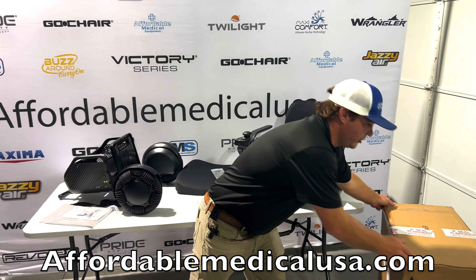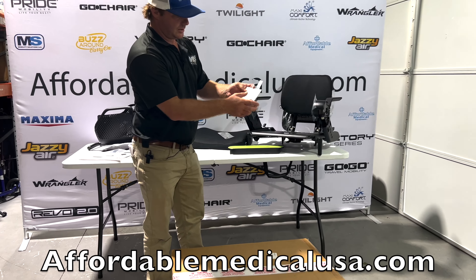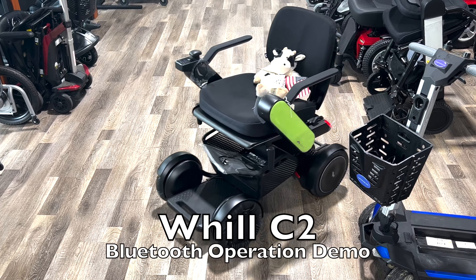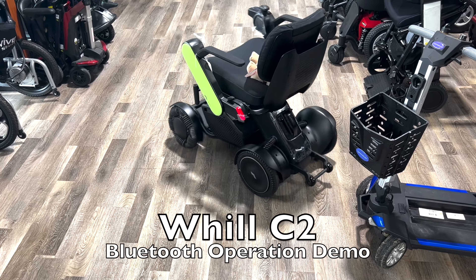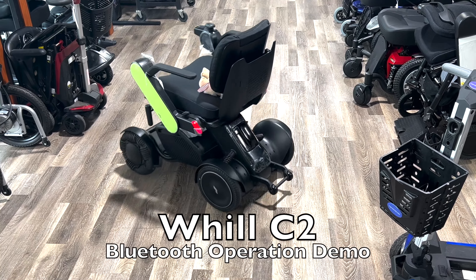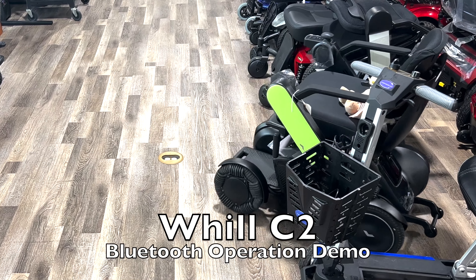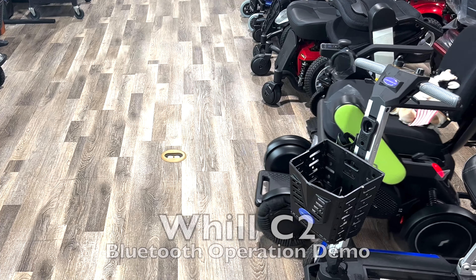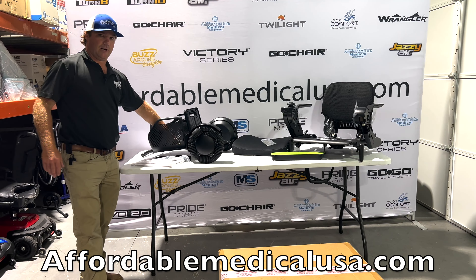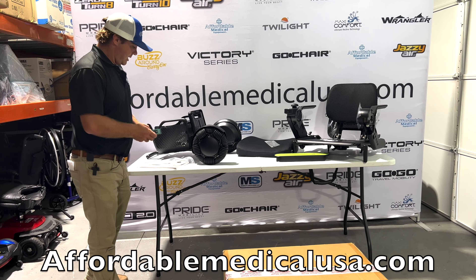We've got one more box to open — probably the heaviest box of the three. They have this tape on the seat too, just so you know. This is your QR code to set up your Bluetooth, which we're going to show you. The seat cushion front half — this basket is removable. We went ahead and put the straps on it so it doesn't come off, but if you want to take it on and off you don't need that. We're going to weigh it also.